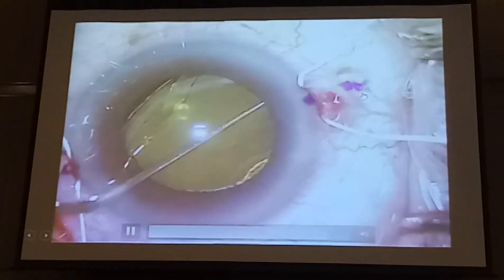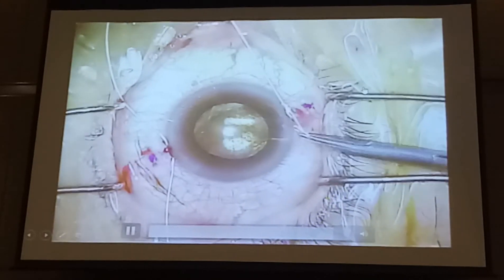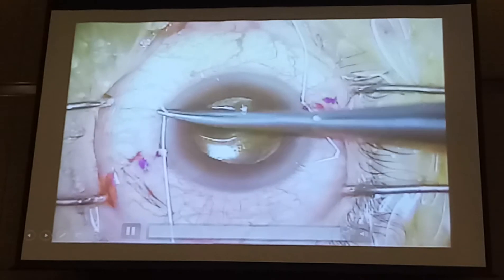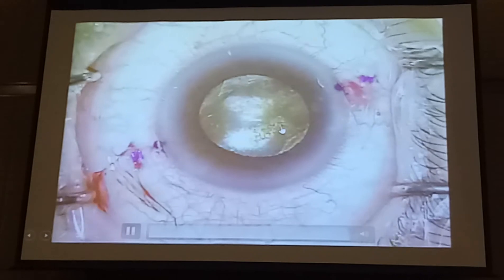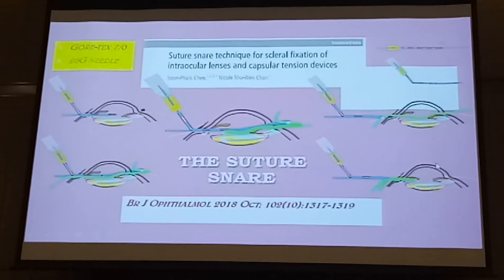So once you've got that, you retrieve your sutures and adjust the tension between the two in order to centre your IOL. You can see that this actually does a good job for this patient without having to explant the lens at all. This is very useful if you've got a toric lens that you don't want removed for the patient. But this patient must have no vitreous in the front of the eye, otherwise it's going to be difficult — because you have to deal with vitreous as well. But you can see it is really very well centred.